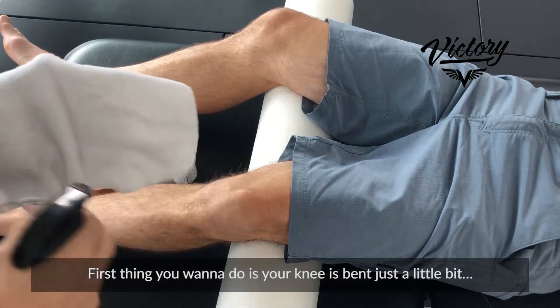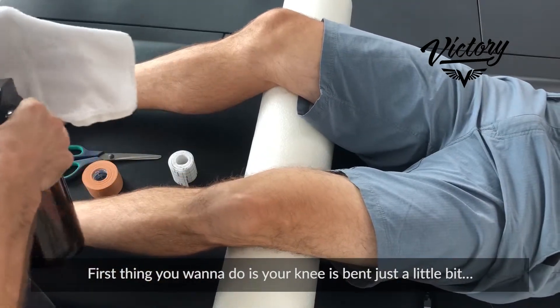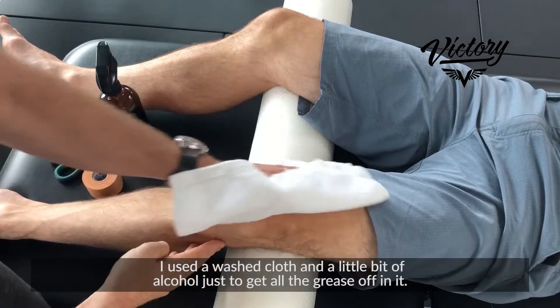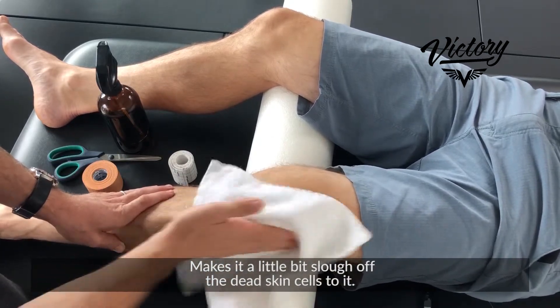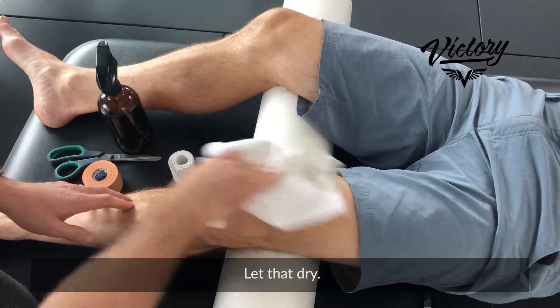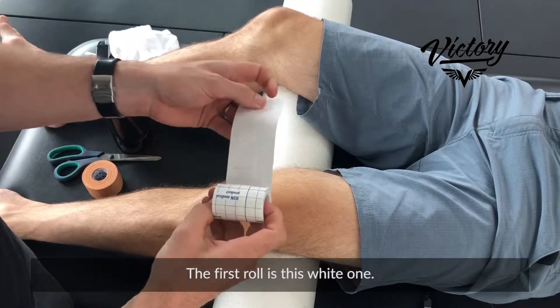First thing you're gonna do is your knee is bent just a little bit. Use a washcloth and a little bit of alcohol to get all the grease off — it sloughs off the dead skin cells too. Let that dry.